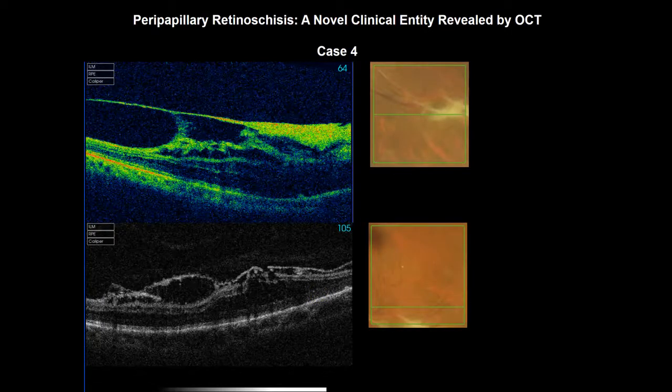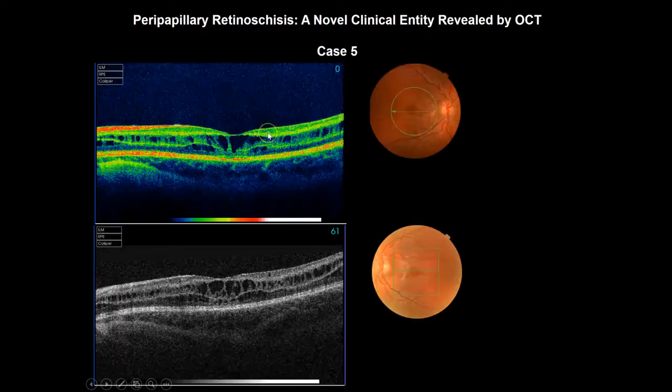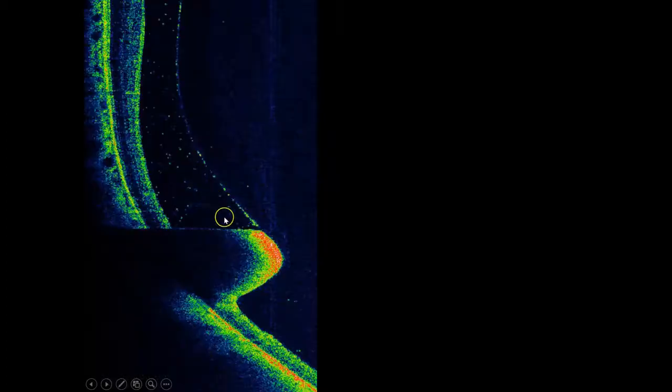This patient has an inflammatory disorder, systemic lupus erythematosus by history, and you can see some extra tissue sitting on the surface of the retina and tugging. So whenever we see something like this, we might want to get an OCT where we may get some more information about what's actually happening to the internal membrane and to the posterior hyaloid. Here's a patient with peripapillary retinal schisis. Here's a schisis right through all these zones. We have one around the disc that we showed you before, and here the schisis is actually in the macula.